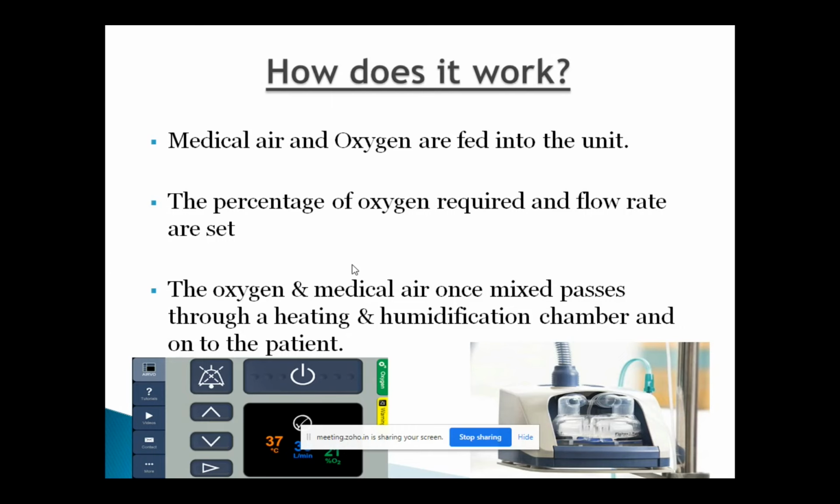So the patient has got excellent benefit of humidification, their tolerance, and you're giving exact oxygen concentration. And also, one of the advantages of nasal cannula, which we read in the first slide: the patient is able to eat, drink, and communicate, which is a very, very important thing.